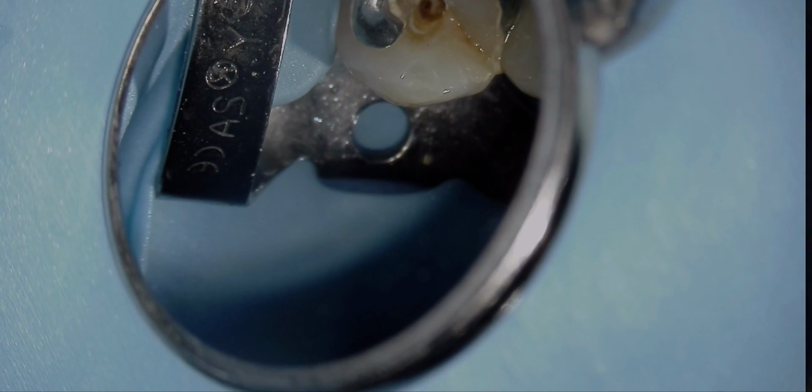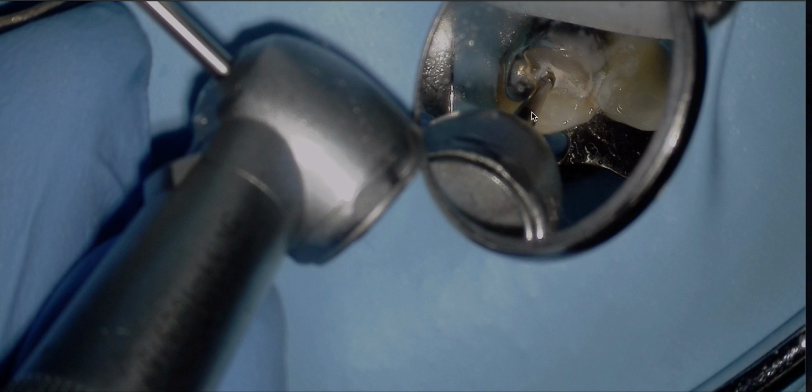Dr. Deutsche Musikant several years ago did an article talking about how deep the pulp chamber usually is, and on average, the pulp chamber in premolars is 7 millimeters. So this little line on my bur, from this line to the tip of the bur, is 6 millimeters. I'm using that as a gauge to see how deep I'm going.